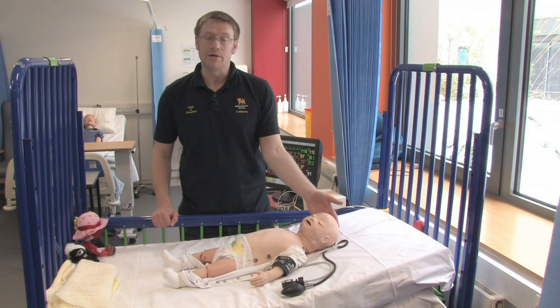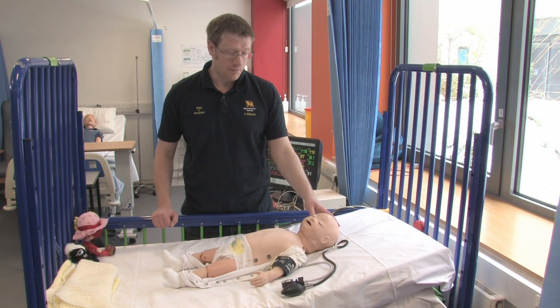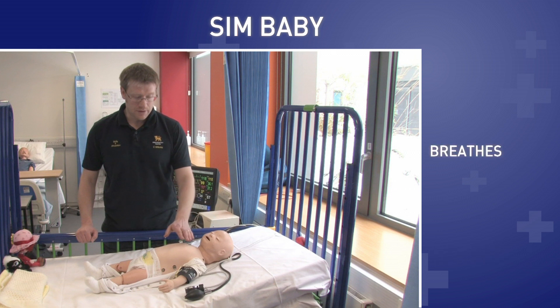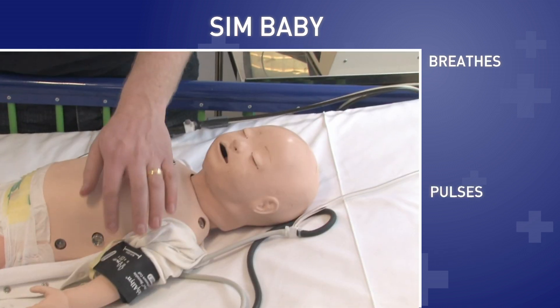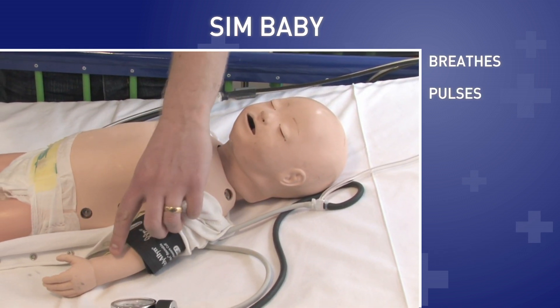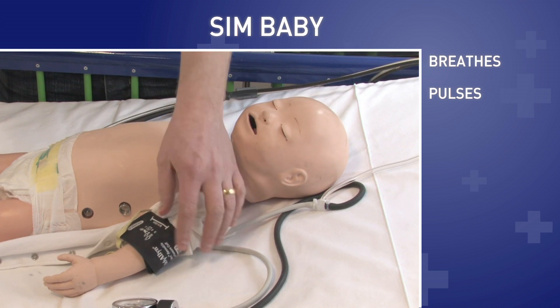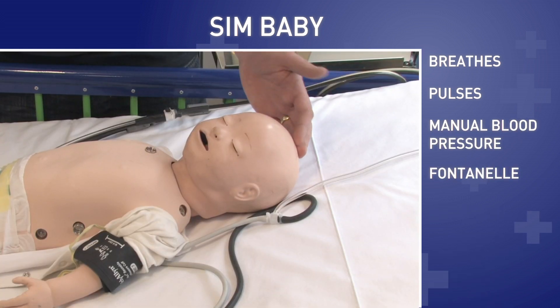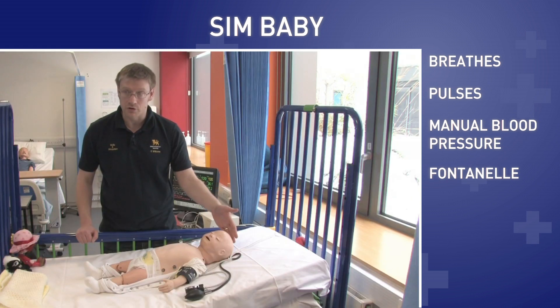This is Simbaby. He's mainly used by child branch nursing along with paramedics and some post-registration nursing. You can see his breathing, he has pulses in his left hand and in his arms. You can also do a manual blood pressure on him. He's got a fontanelle like a real baby would, so you can feel if it's sunken or not.